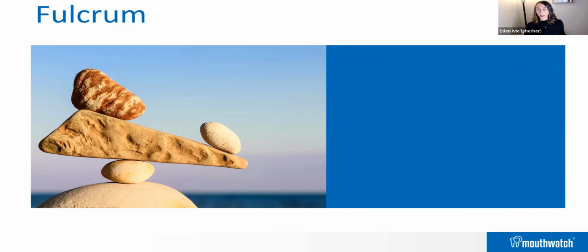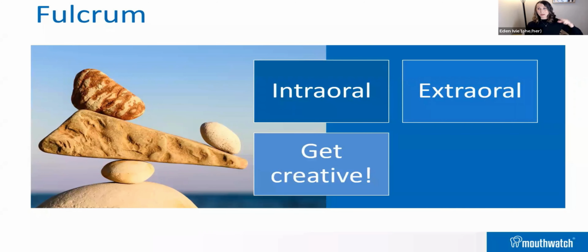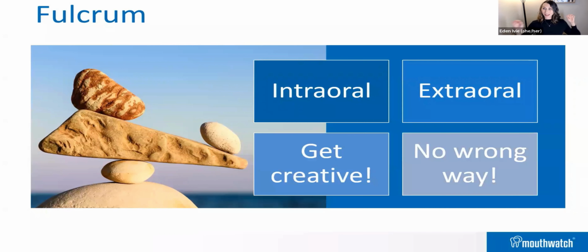And then most importantly, we need to fulcrum. We are going to use intraoral fulcrums, extraoral fulcrums. We're going to get creative and remember that there is no wrong way to fulcrum when you're taking intraoral images. And we're going to go through some techniques to stabilize.